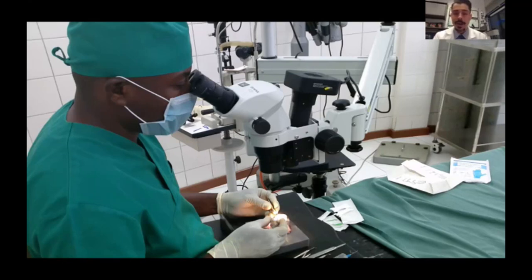Not very fancy. The microscope that you see here was actually one of several dedicated microscopes for our operating block. This microscope, we took out on our traveling cataract camps, and so we use this for the wet lab setting. It's a Scan Optic microscope, relatively cheap, comes out of Australia. I think this microscope sells for less than $4,000, and it's not the best optics of any microscope that I've used, but certainly good enough for the wet lab setting.